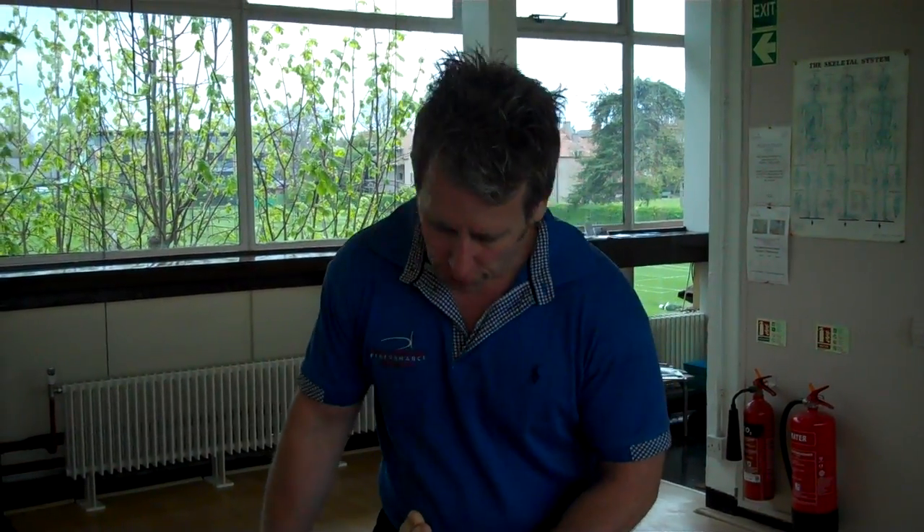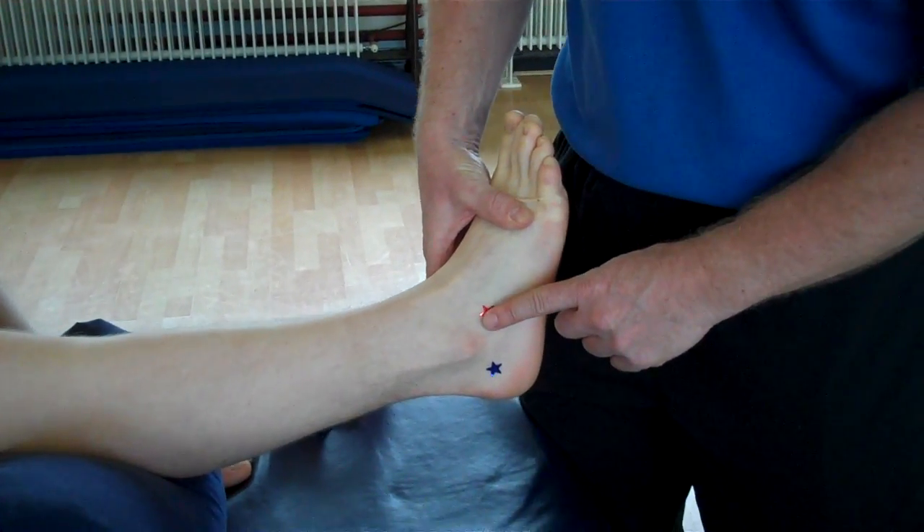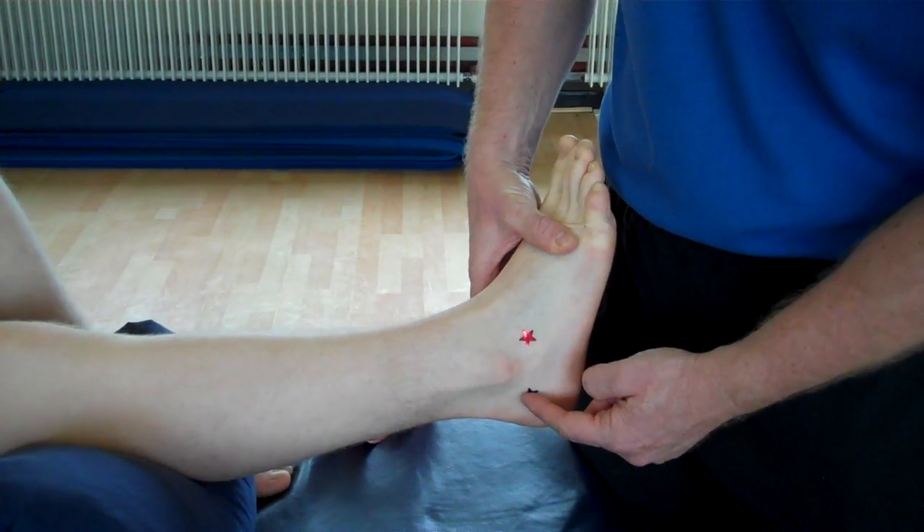Hi, my name is John Gibbons and today we're going to look at ankle stabilization using a very simple J-strap with kinesiology tape. First of all, we're going to look at the ligaments. This is the ATFL ligament — the anterior talofibular. This is the calcaneofibular ligament.